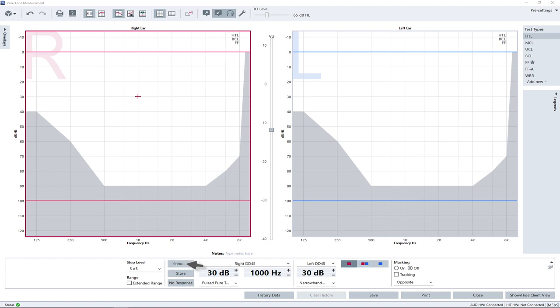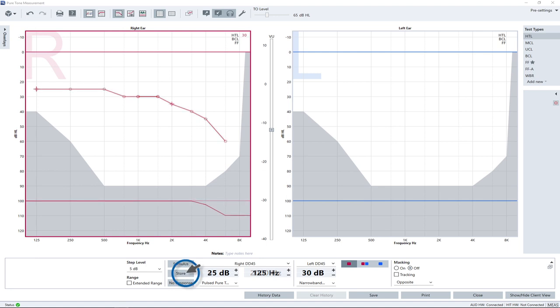To store the threshold, click on Store. After the threshold is stored, the program jumps to the next frequency in a predefined sequence. Continue this procedure for the default frequencies or any frequency of your choice.